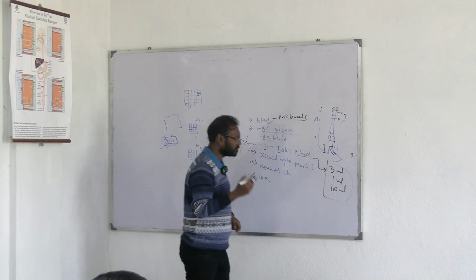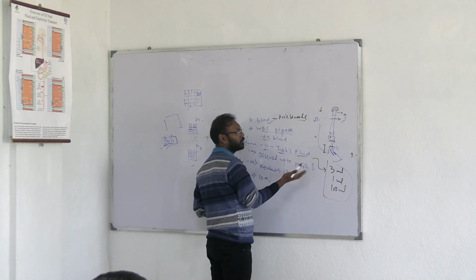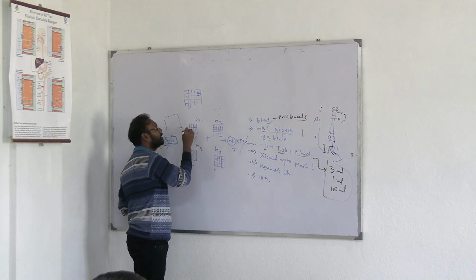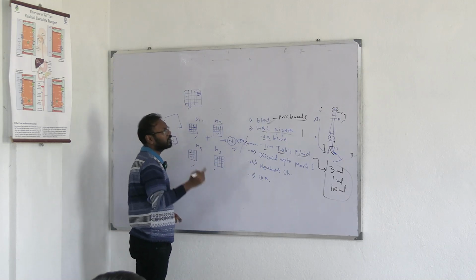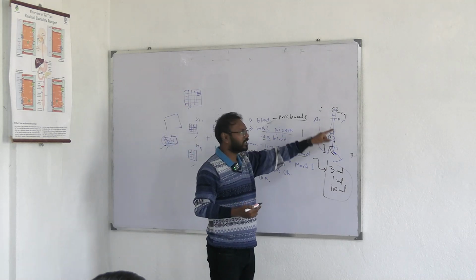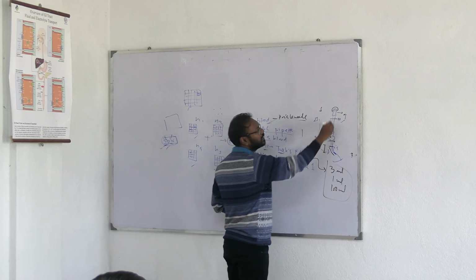Actually, since that diluting fluid, that Turk's fluid, was more, the density of WBCs in those areas was very low in some cases. Now, on the first day this can also happen. So I am warning you, as a preventive measure, that you should only draw up to 11. Okay, up to 11 only, and draw slowly.